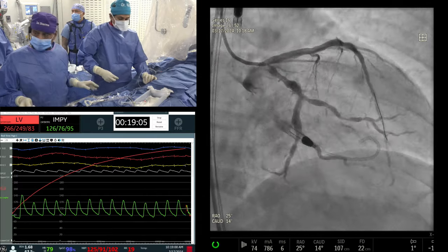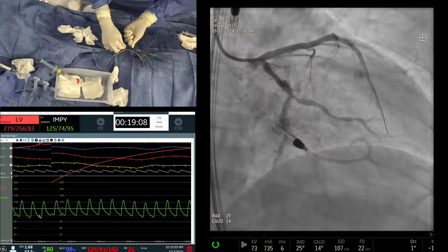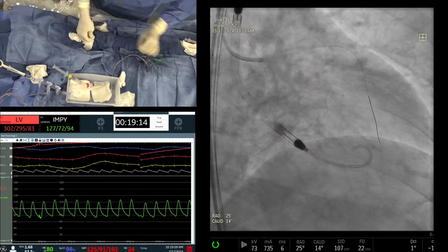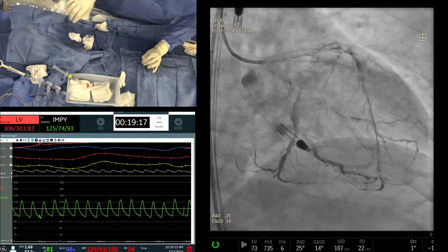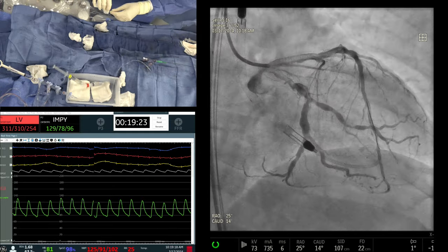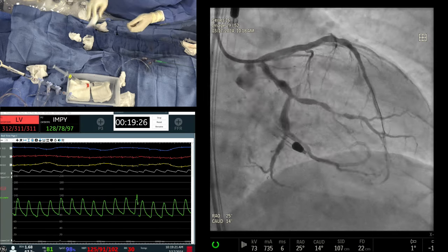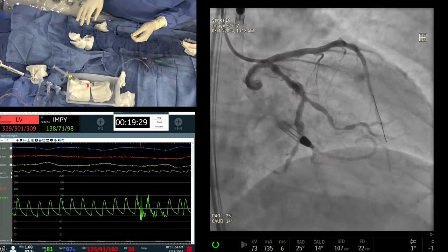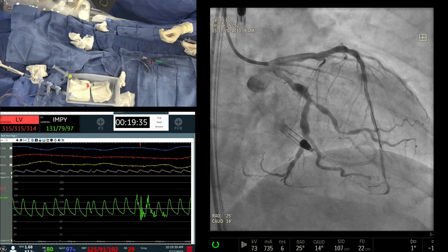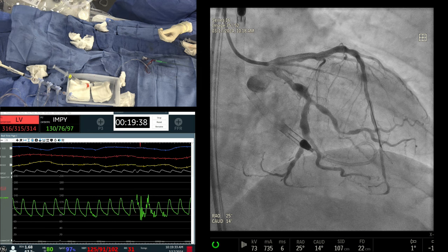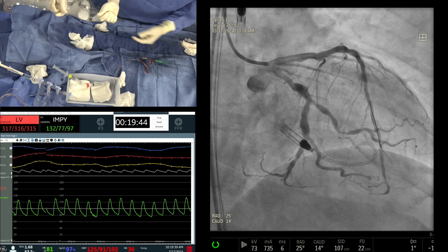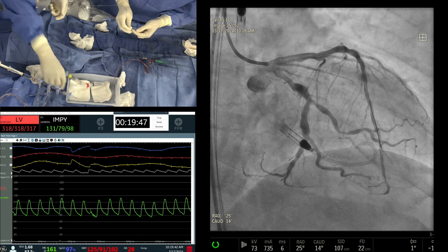Post-dilation with a 4.0x30 high-pressure balloon. We put a 4.0x33 stent, then will post-dilate with a 4.0, then do OCT. I'm still concerned about that ectatic calcium area — that's what we are going to learn from the OCT. If you have good pre-anticoagulation and antiplatelet therapy, see no slow flow. Usually you'd expect slow flow from distal microvasculature obstruction or embolization, but nothing happened in this case. With a low EF we try to avoid vasodilators, then use nipride as needed.